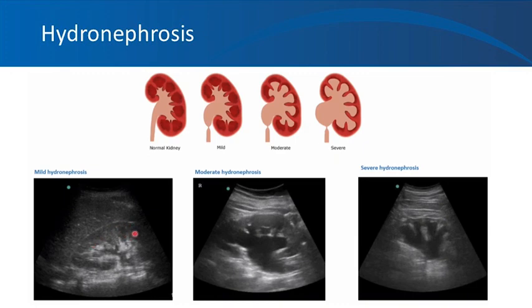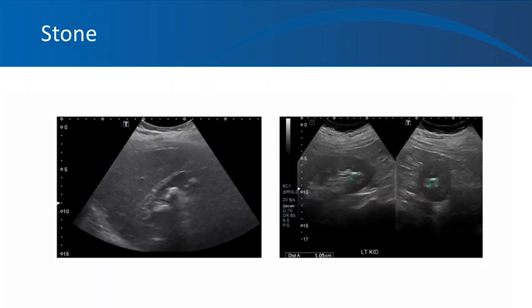and medullary pyramids. And this is moderate hydronephrosis, where here you can see the dilated proximal ureter also, and more dilated renal pelvis extending into the renal parenchyma, and calyces becoming a little more convex. Some radiologists describe this as cauliflower pattern also, the convex architecture of the calyces. And as the hydronephrosis becomes severe, pretty much now you cannot see any pyramids or any parenchyma, the cortex has become very thin, and the entire kidney is filled with urine.